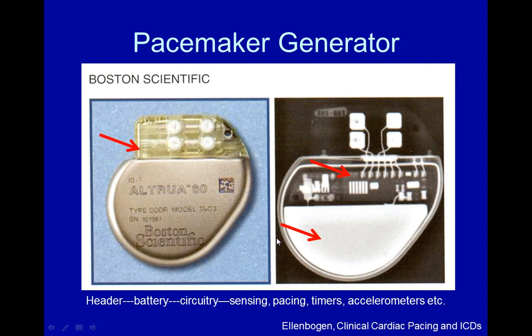This is a picture of an actual pacemaker. This is the battery, the bulk of the pacemaker. Here's the circuitry, and you can see how the circuitry is connected to what's called the header, where the pacing leads are connected.